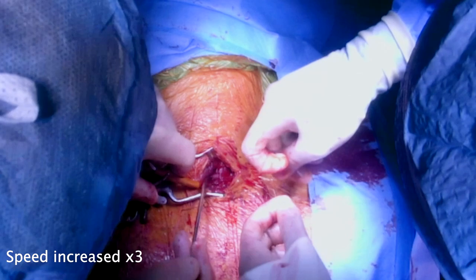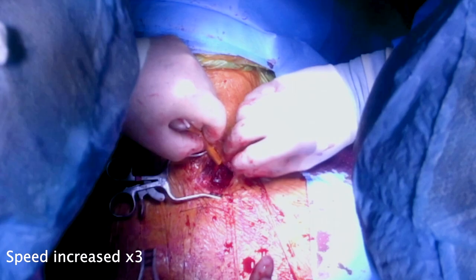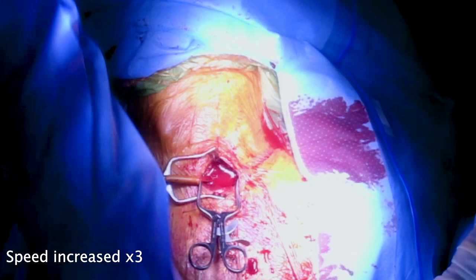The arterial sheath was removed and the pre-closure suture was tied. The umbilical tape around the left common carotid artery is useful in the mobilization of the vessel.